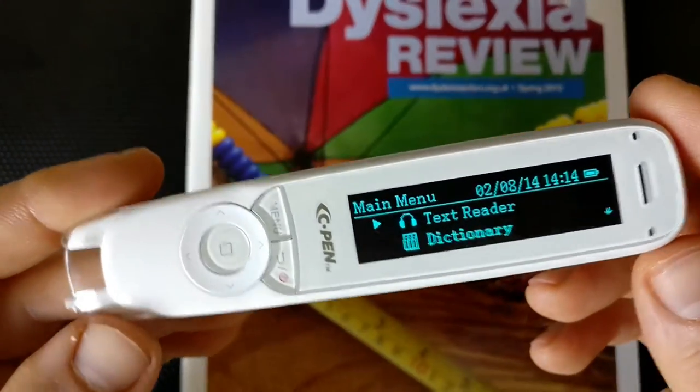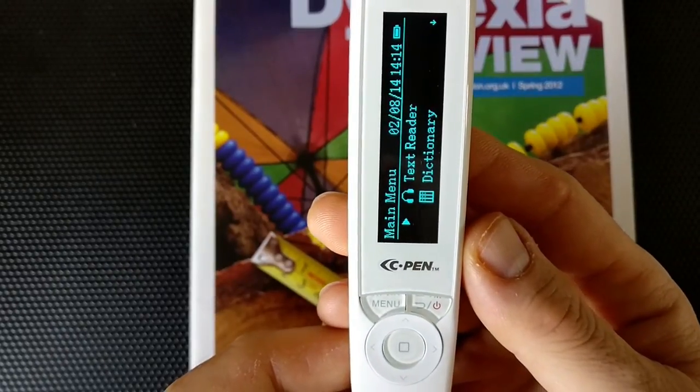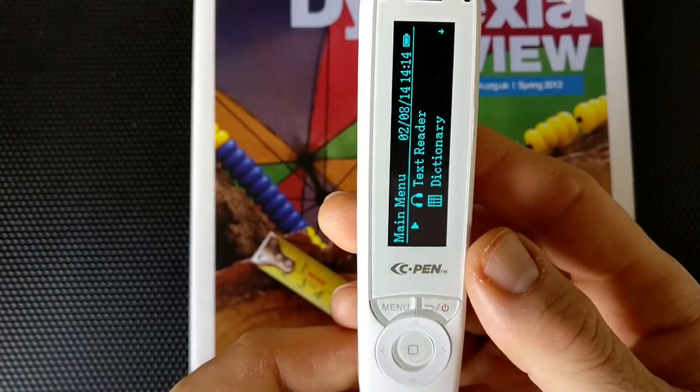So that is the C-Pen reader pen. We will now have a look at some of its other functionality in a separate video. Talk to you next time.